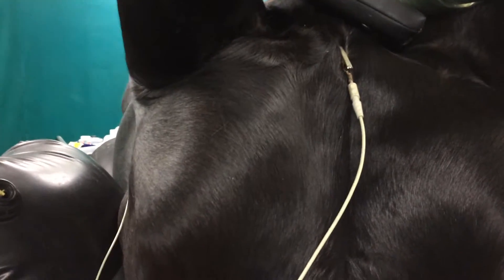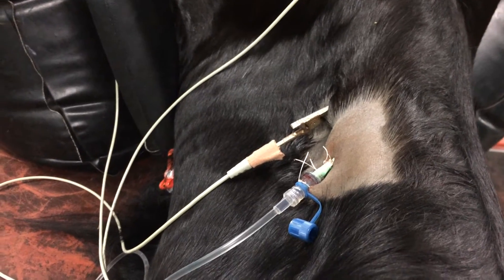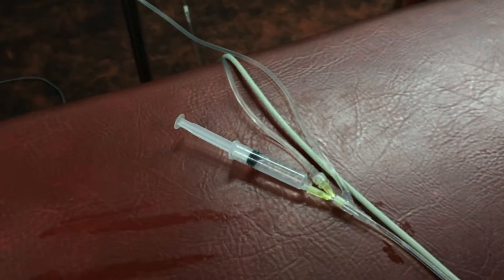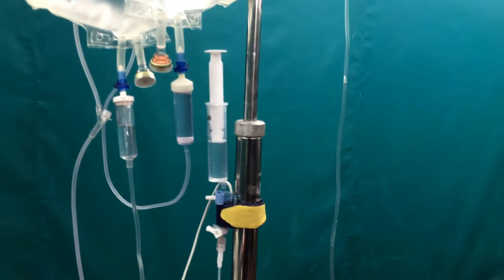You can see we also have an ECG and these are the ECG leads collecting the electrical activity of the heart — one on the sternum, one on the chest wall, and one here on the jugular groove — and also an intravenous line. Here we have a top-up of ketamine in case the horse wakes up, in our intravenous line through which we have continuous fluids flowing.